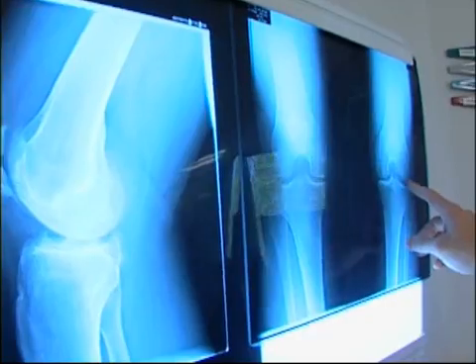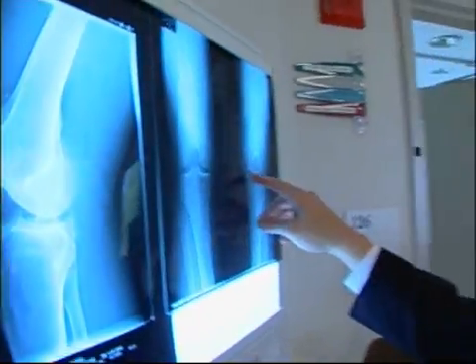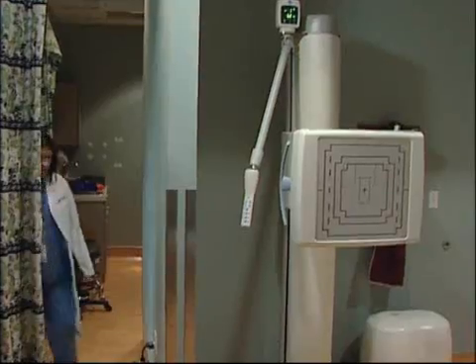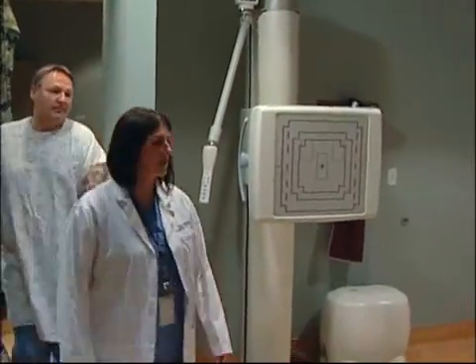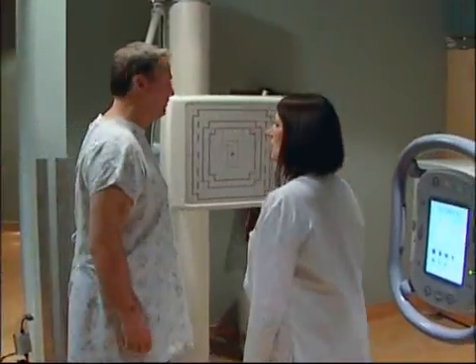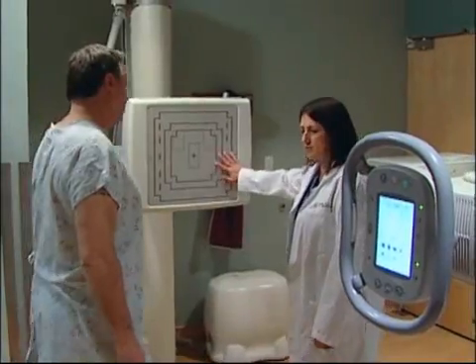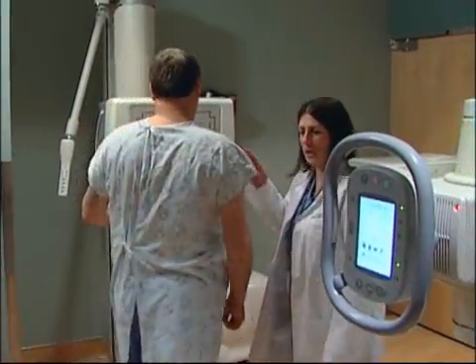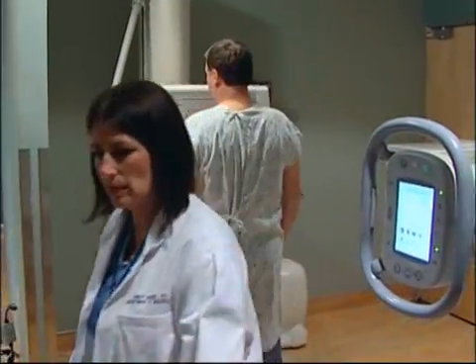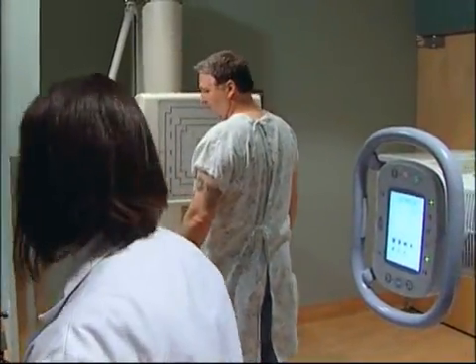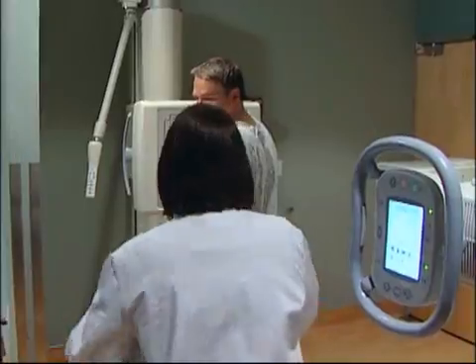Radiography, or an x-ray as it's most commonly known, is the oldest and most often used form of medical imaging. Come right in here, Patrick. We're going to do a chest x-ray today. Digital Radiography is an advanced form of x-ray imaging where digital x-ray sensors are used instead of traditional photographic film.